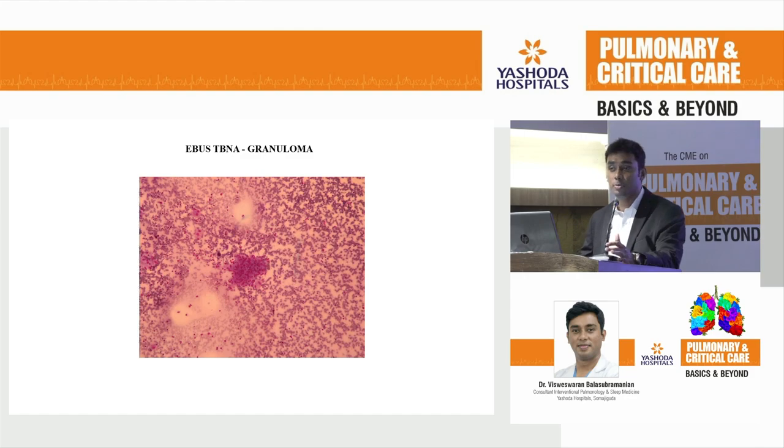This is a very, very common scenario. What I am showing is only one of the cases amongst 15 cases. In 15 cases, the EBUS really changed the management because whatever was taken as a PET avid node later came out to be a tubercular node.